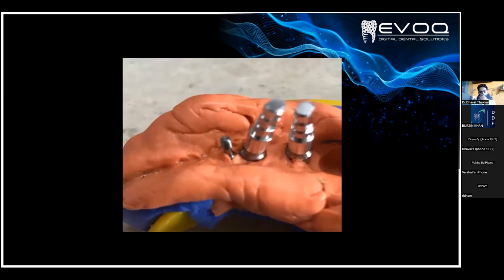Imagine this situation. We got this impression into the laboratory where only one prosthetic screw was used to take the impression, and there were two transfer copings. So we got an impression in a condition where two lab analogs were attached and one screw was fitted like this. We asked the doctor what this condition was. The doctor explained that he was not able to fit all three transfer copings parallel together because of the condition of the transfer copings on the clinical side. So it is impossible to take this implant position into the laboratory with a manual impression.